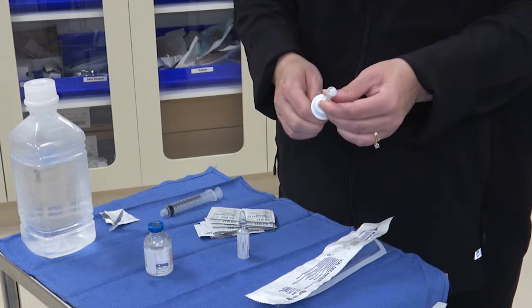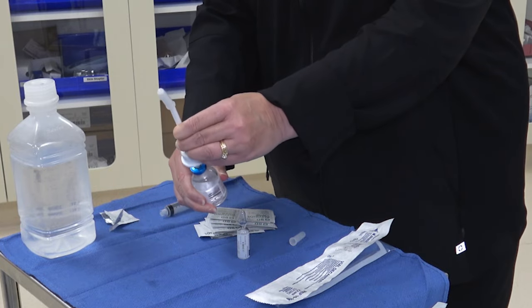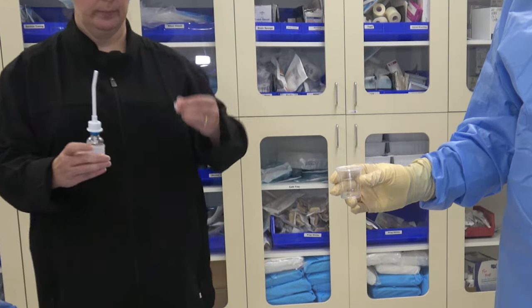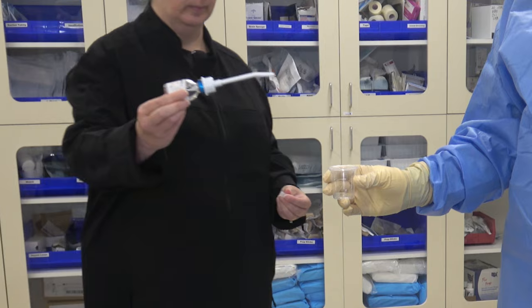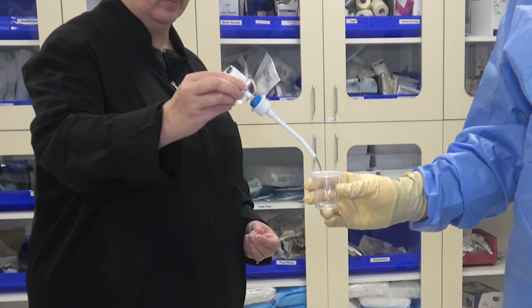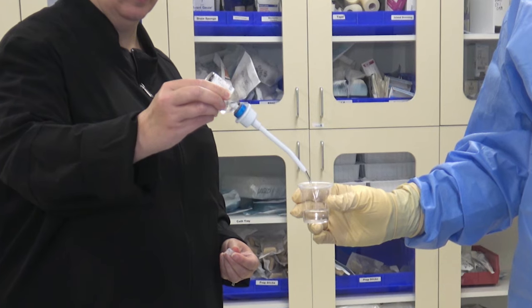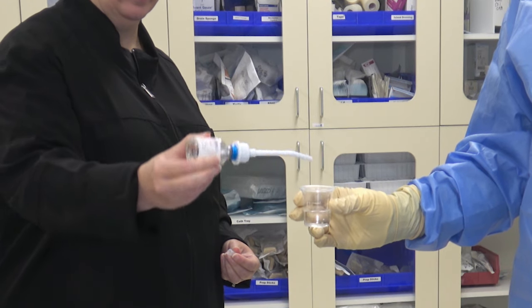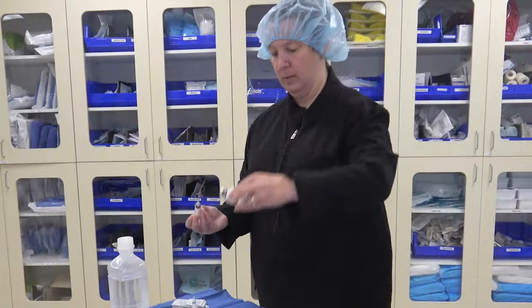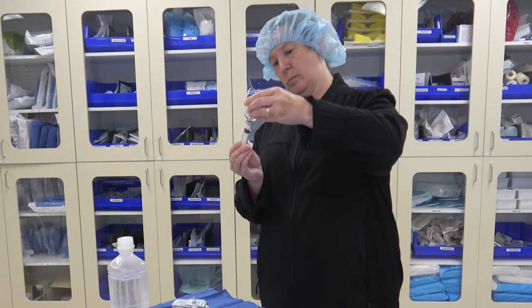Without touching the pointy end, the circulator inserts it through the rubber stopper. She will then remove the other cap and place only the sterile tip over your medicine cup and pour in the medicine. To be extra sure, the tip of the decanter should never touch the medicine cup.